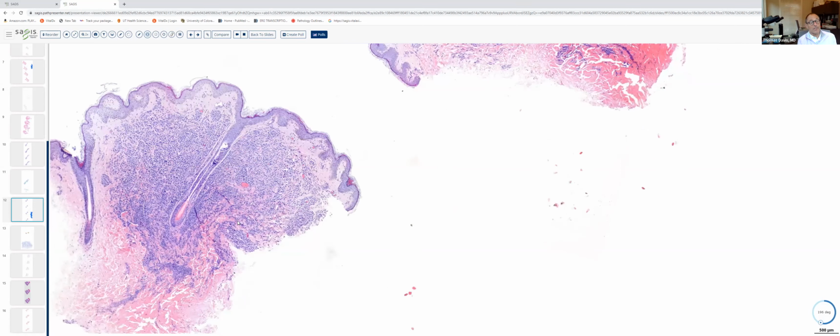One of the things that one thinks about right away, because these cells are nested, is the possibility of a melanocytic nevus. That would be topping my list on scan. We've got nests, and we've kind of got splaying of the infiltrate between collagen bundles, with some attributes of a congenital melanocytic nevus.